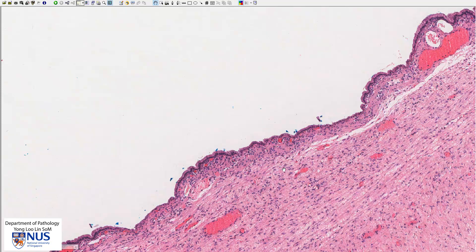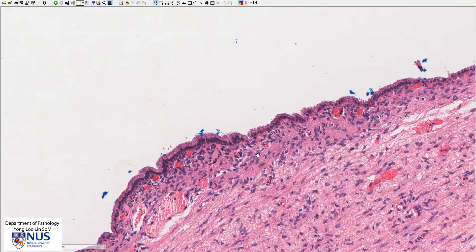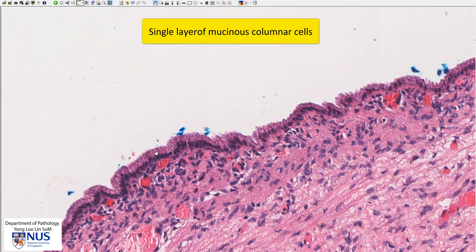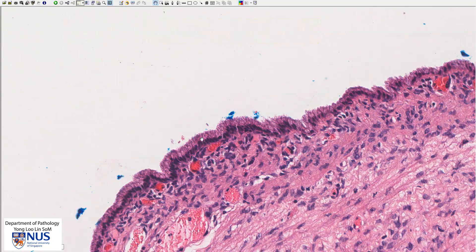Let's have a look at the lining epithelium. We can see that this is a single layer of columnar cells. The nuclei are small, they are very uniform, and they are basal — polarized to the basal aspect of this columnar cell. There is abundant mucin in the cytoplasm.